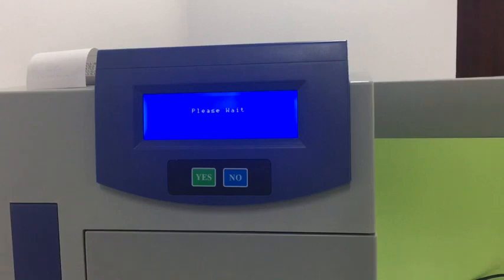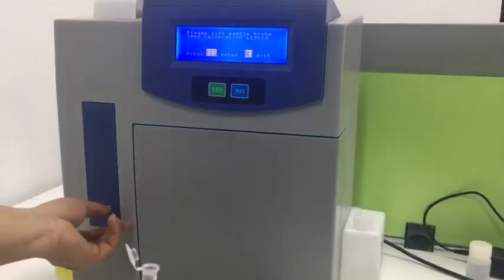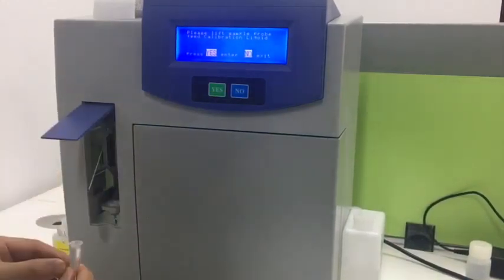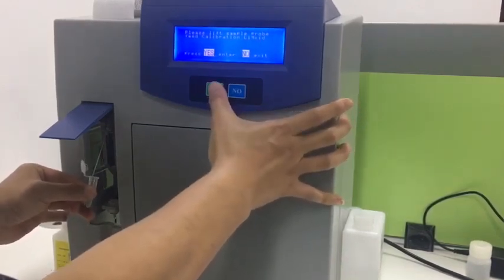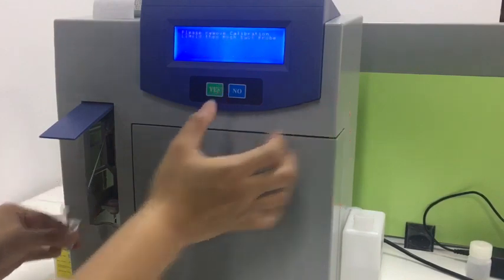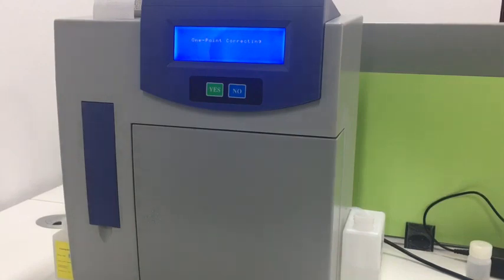We wait for a while. After a moment, it will show this page. Then we use this solution to feed the sample probe, then press 'Yes' and close the sample probe. It will perform the one-point correction automatically.